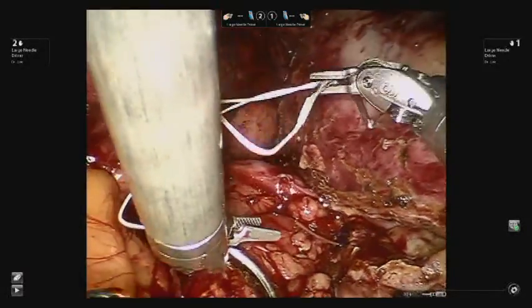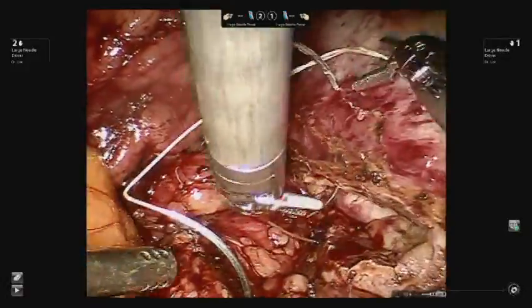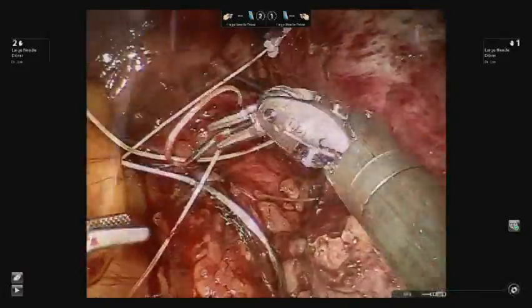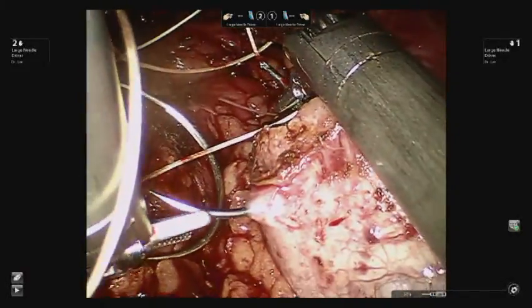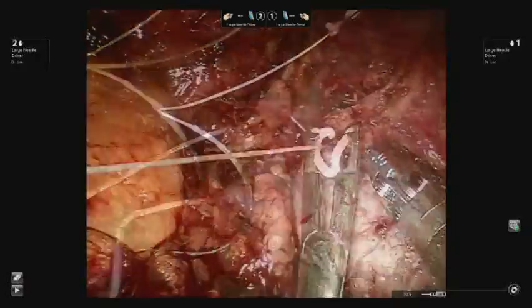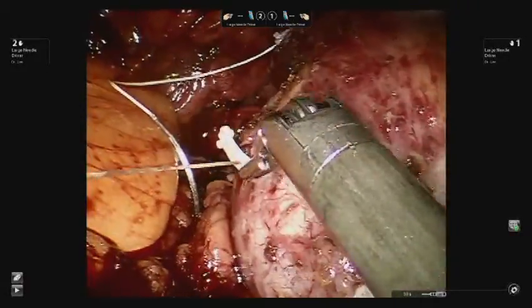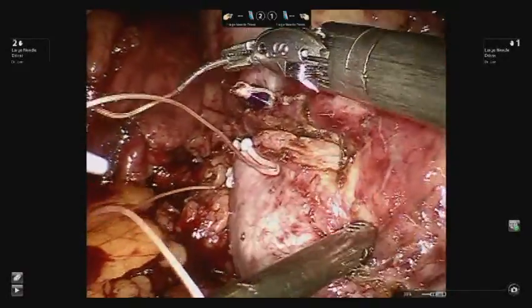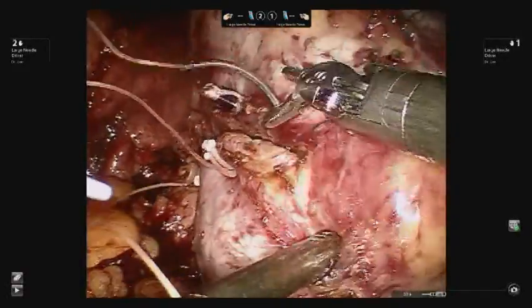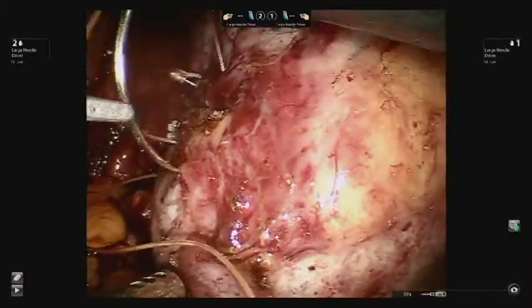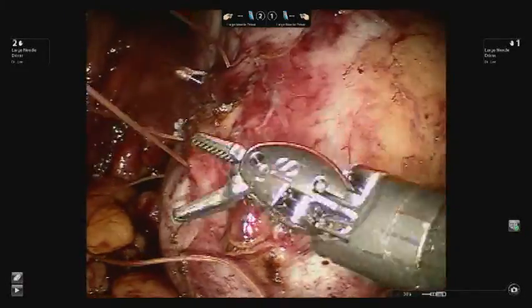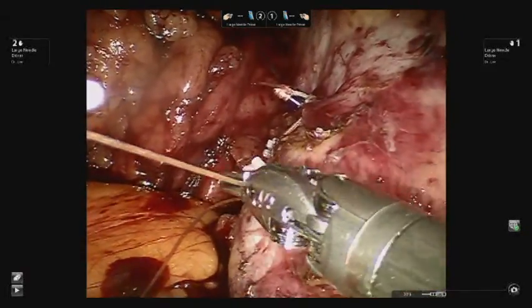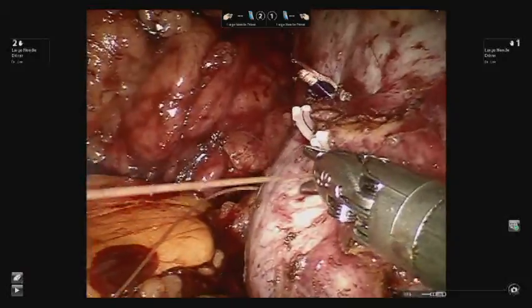A double-arm zero Vicryl suture is used to reconstruct the renal capsule using the sliding Hem-o-lok clip technique. Visual cues regarding the compression of the renal parenchyma are observed with dimpling of the surface of the capsule.